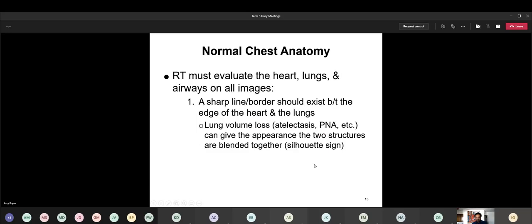Okay, so moving on, when we look at our x-rays, we know that there are certain things that we should always be looking for. And the heart obviously should show up on the film, no matter whether they did a film with a poor technique or not, you should still be able to see the heart. And of course, we're looking at lungs overall as far as, is there air in the lungs or is there too much air in the lungs? Do you even see your lung markings? Do you see everything that you're supposed to see?